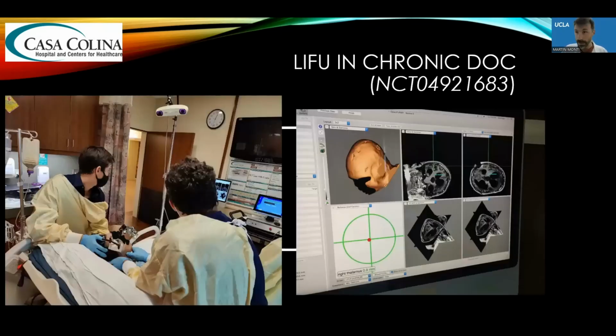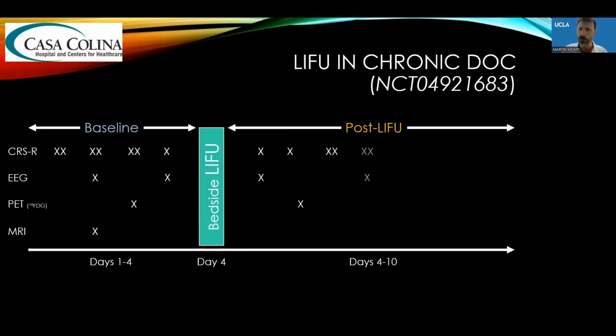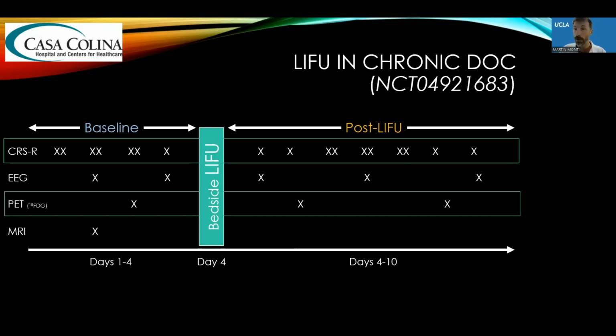But we do this at the bedside, as you can see here. So here you can see two members of my group administering ultrasound, and instead of being inside the MRI, the MR guidance is done with a frameless stereotactic device, which you can see portrayed on the right side. And then, following this administration, we follow up for the next 6 days with additional clinical, electroencephalography, and positron emission tomography assessments. Again, for the sake of time, I will really focus on two things: the clinical results and PET, just because PET is really a hallmark biomarker in these patients.